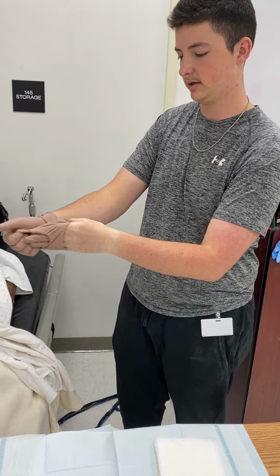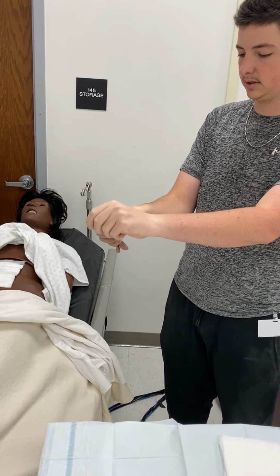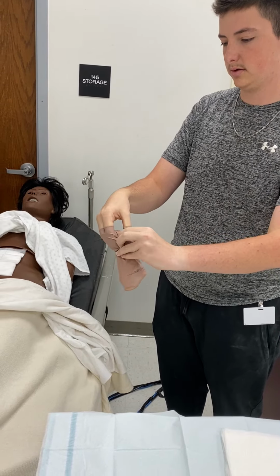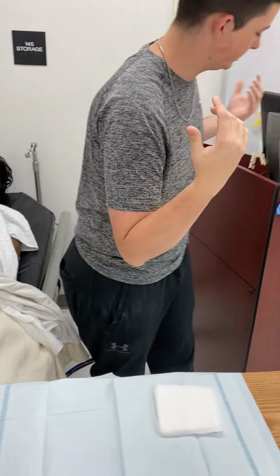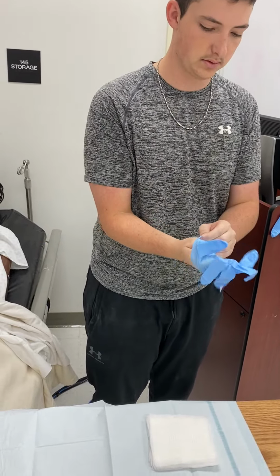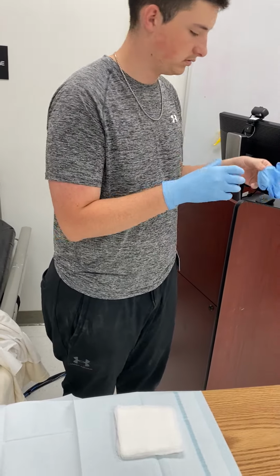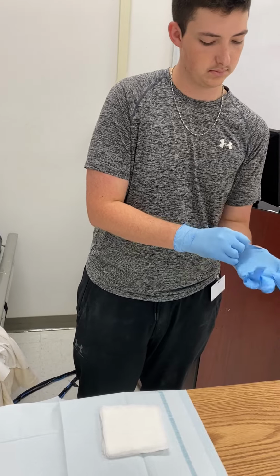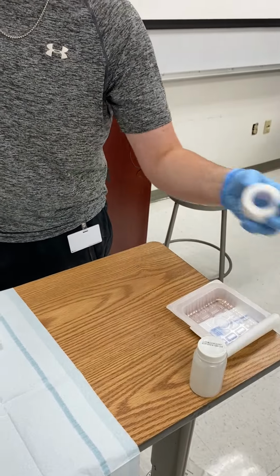Sterile technique. Still maintaining sterility. Okay. Now I'll be donning clean gloves. Tape.